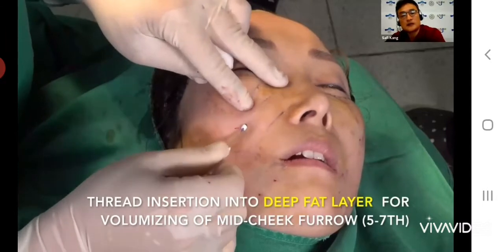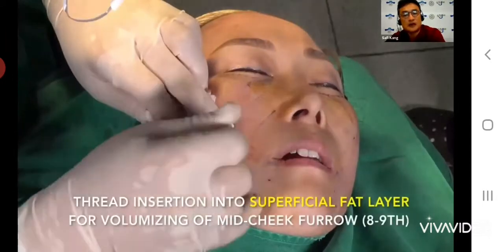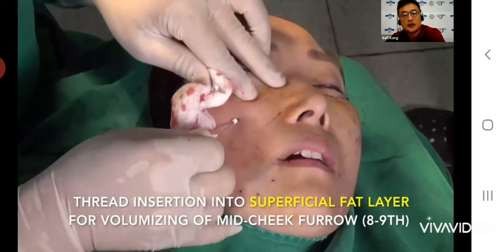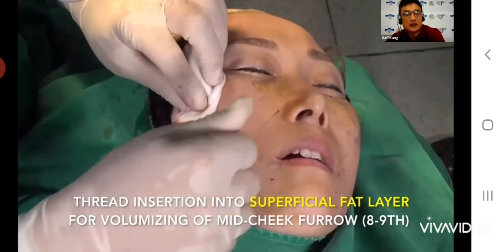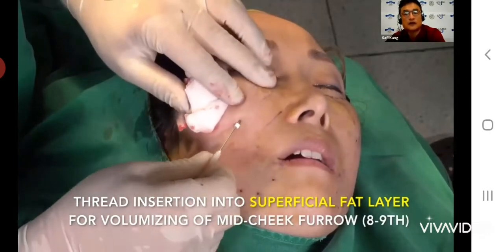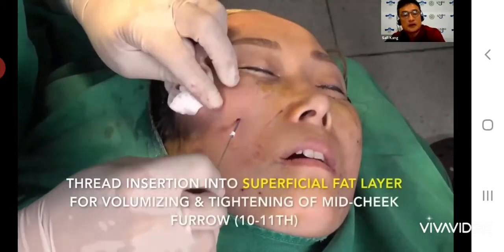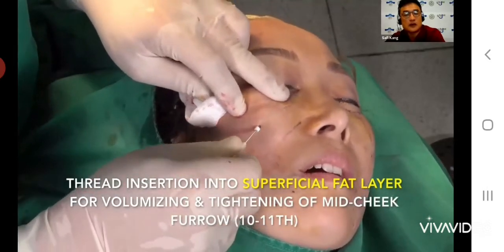But sometimes the patient has very thin skin in the midline. The skin also thins, so I inject the filler in combination, at least 2 weeks after healing, for skin thickening. This is a thick cannula, and I used just one entry site.